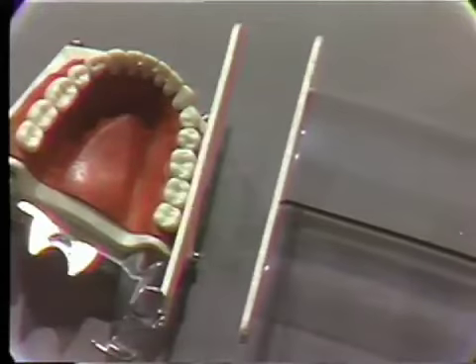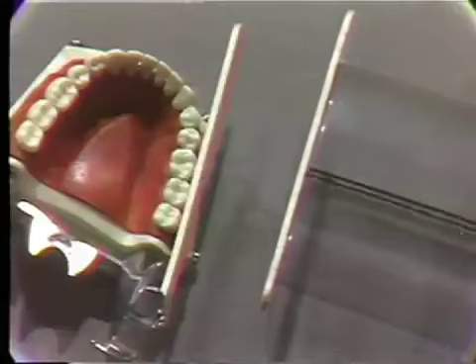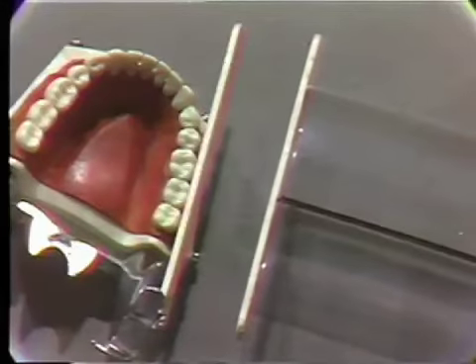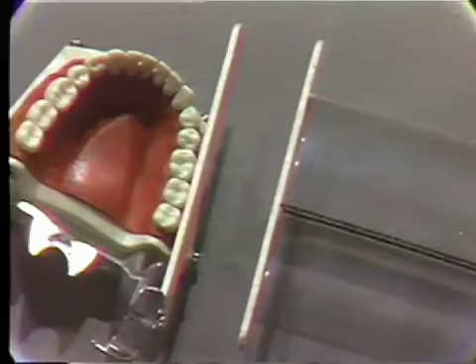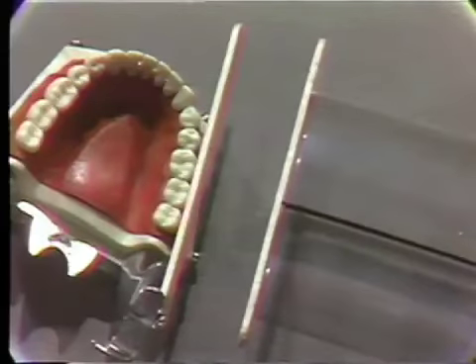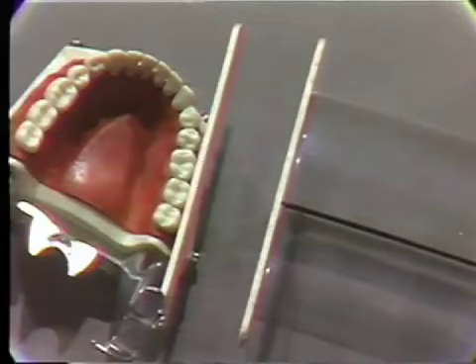And then I move the cone in so that finally the two sticks are parallel. Now you notice the path of the central ray indicated by the black line is aimed between the first and second molar, and the two sticks are reasonably parallel. Now this parallelism is easily seen if you view your patient from the front of the mouth.